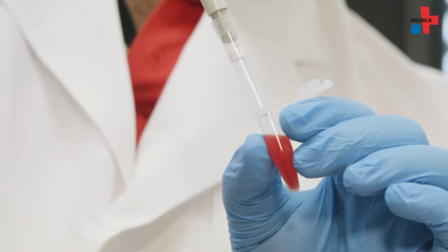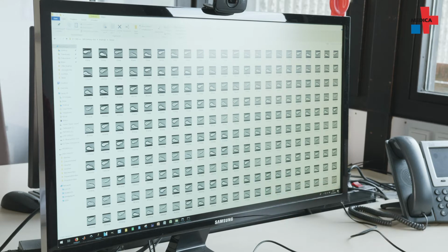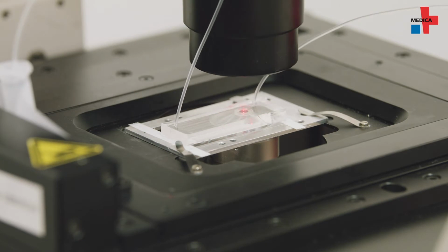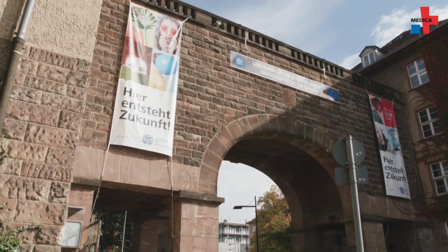Our blood reveals a lot about our physical health. The shape of our blood cells sheds light on several hereditary diseases, for example. For a diagnosis, the cells must first be examined under the microscope and categorized into a specific cell class. We met Dr. Stephan Quint and Alexander Kihm of the Institute of Physics at Saarland University, who explained how this classification works.